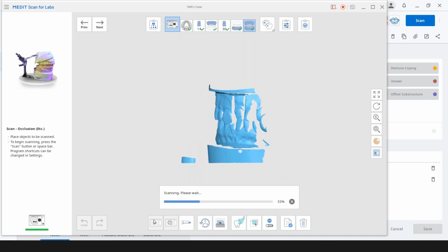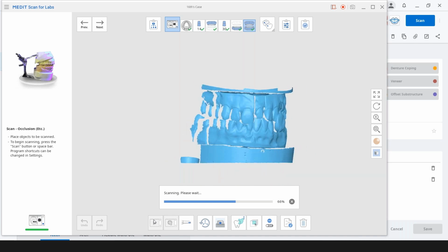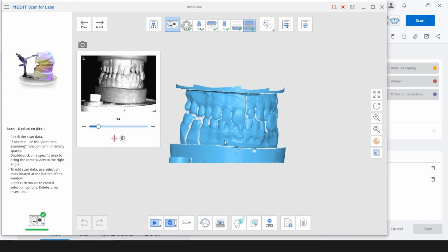So this is a very quick scan because it's not really trying to register a lot of detail. It's just picking up a relationship. You can see my blue tack here on the side, just holding it together. If you have a rubber band on there, you can also see it, but it's usually not in a critical position. So I'm going to go ahead and trim that now. I'm going to use the box and just reverse what I usually did before. Instead of deleting this, I'm going to crop it. That saves me from circling the upper and deleting it, circling the lower model base and deleting it. This does it more quickly. So that's taken care of. I still have just my 2 icons here, additional scan and scan. So I'm going to go to next.